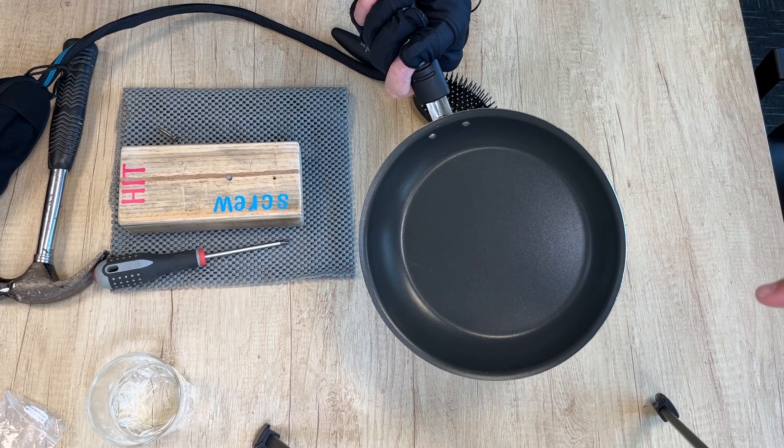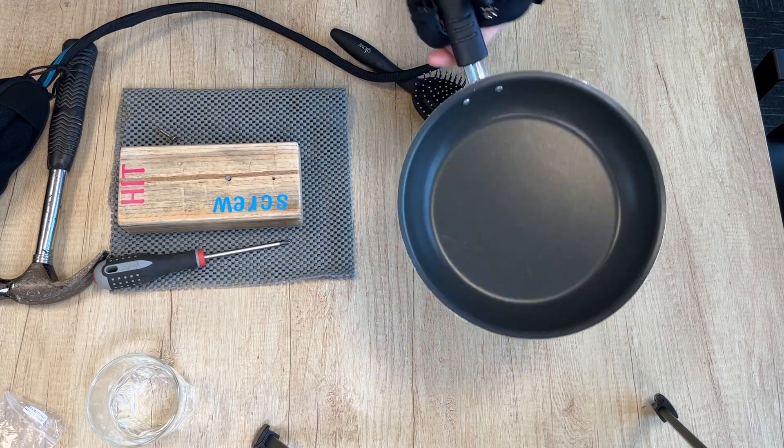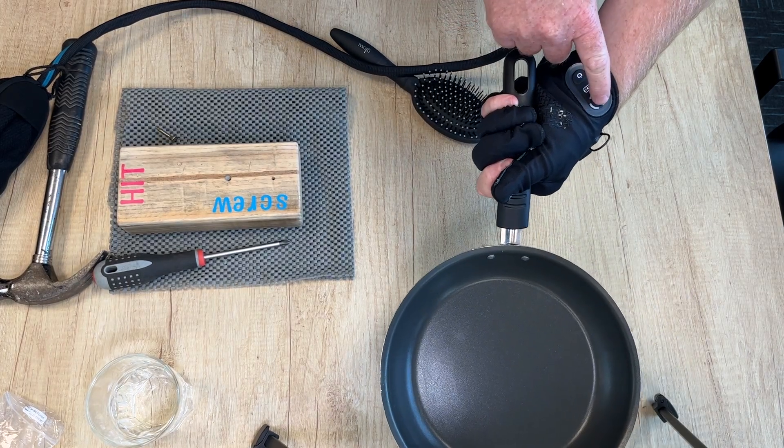The Carbon Hand can hugely support people with impaired grip by improving their grip strength and endurance in everyday tasks — whether that's holding a spoon to prepare dinner, lifting a mug, watering plants in the garden, or doing more challenging things that perhaps you wouldn't think were possible anymore.